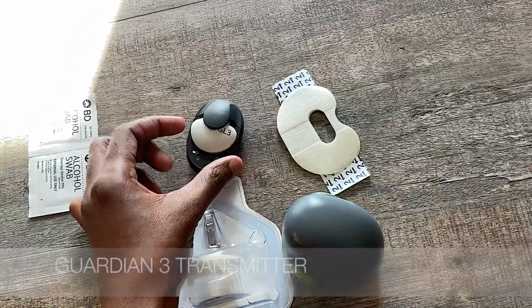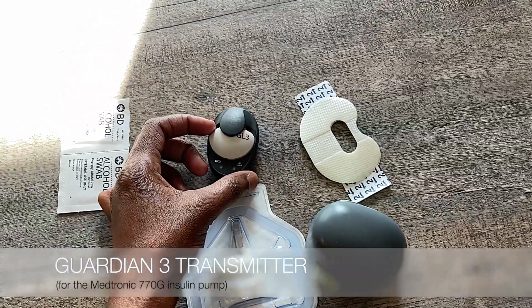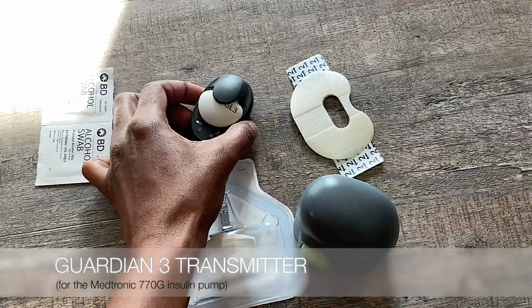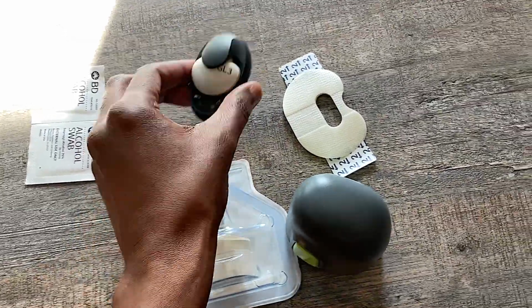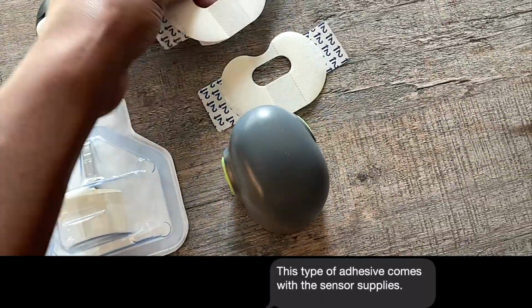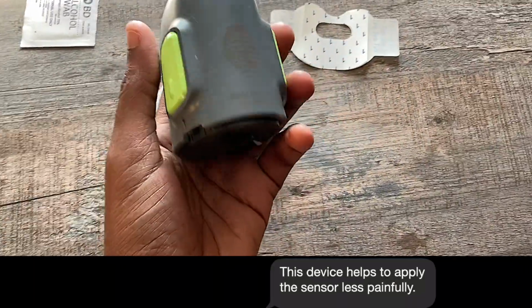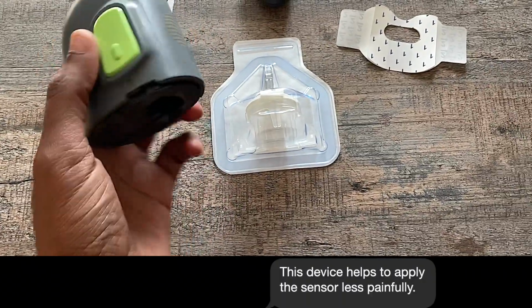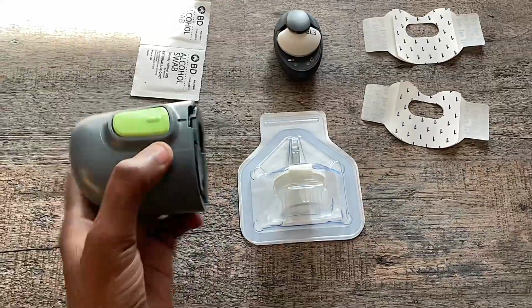This is the continuous glucose monitor, CGM. And it's on a charger right now. It's fully charged. And here we're gonna need two pieces of tape. And this is what the sensor goes into in order to apply it to my skin.